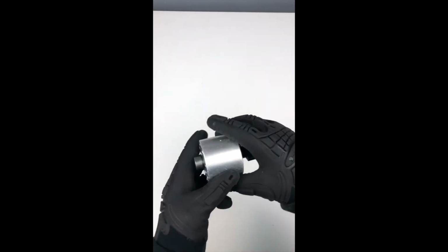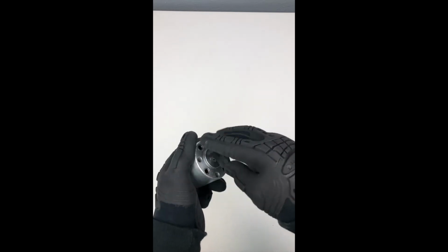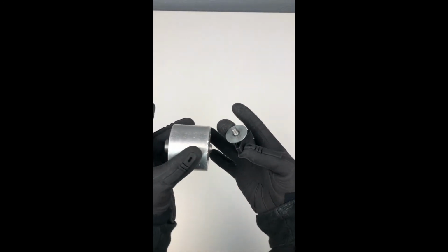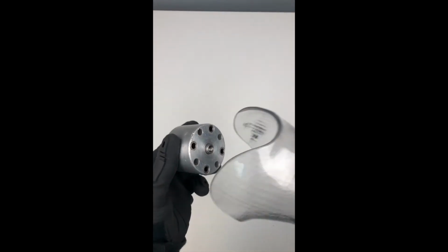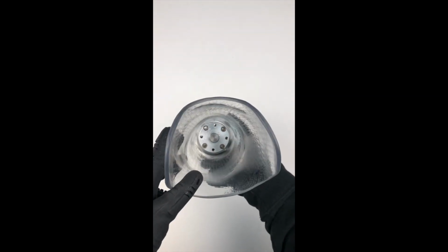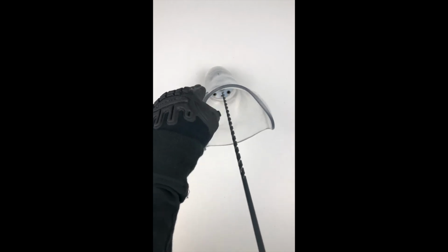A good alternative to establish a 4-hole pattern in the distal aspect of the socket is to utilize a 4-hole drill guide. To use this tool, it does require a 1/2 inch center hole in the distal aspect of the socket. Simply slide the tool into the distal aspect of the socket, orientate the 4-hole pattern in the line of progression, tighten the distal nut, ensure the pattern is correct, drill out the 4-hole pattern.